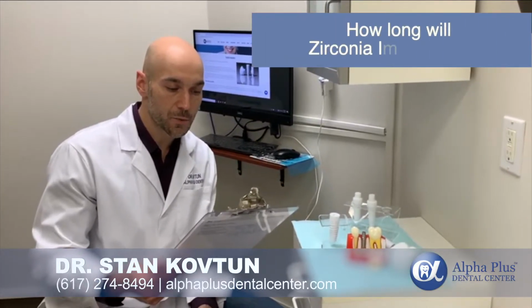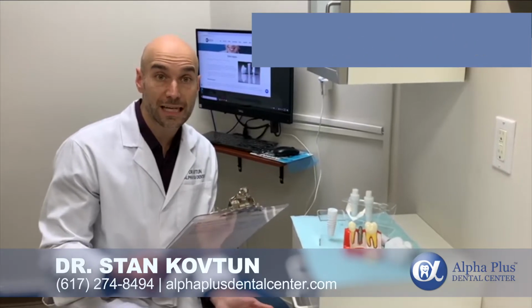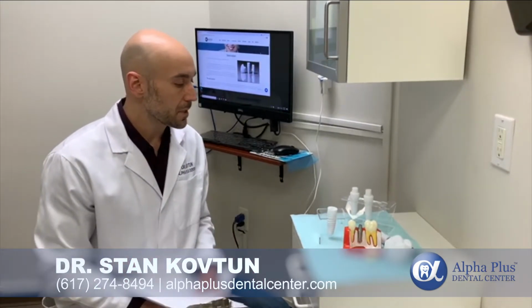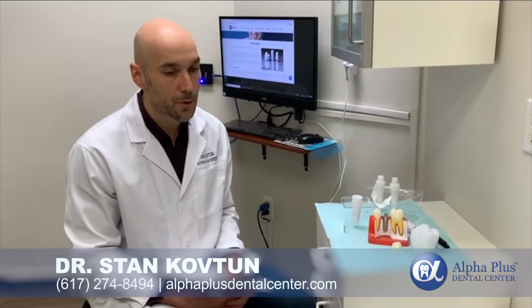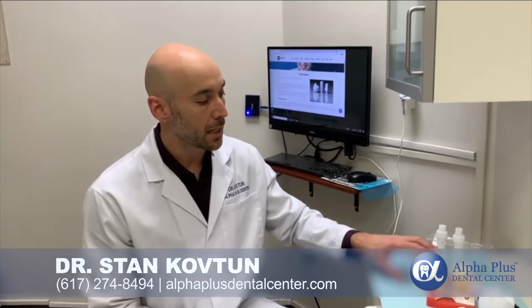One of the other questions was, how long do the zirconia implants last? So it really depends on how well you take care of your teeth. The mouth is a very sort of harsh environment. There's bacteria. We're drinking cold sodas, very acidic things. So the more you take care of your implant and the rest of your teeth, the longer it's going to last. It should last just as long as titanium.